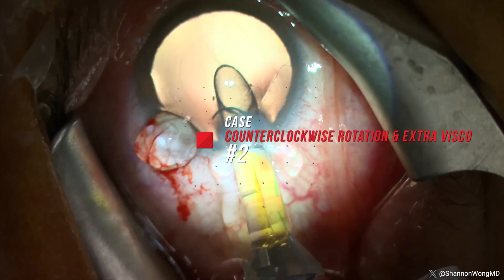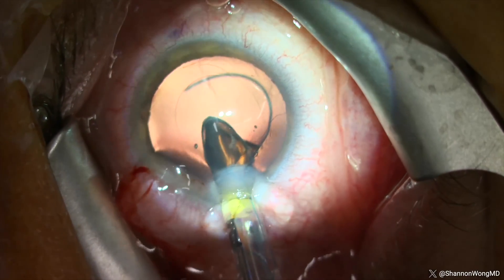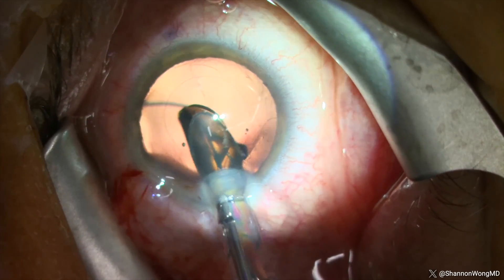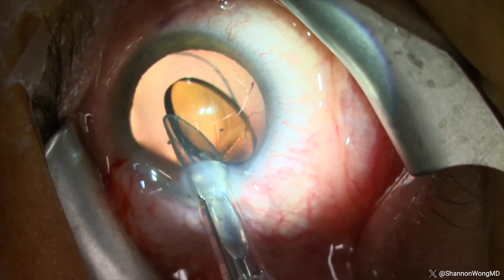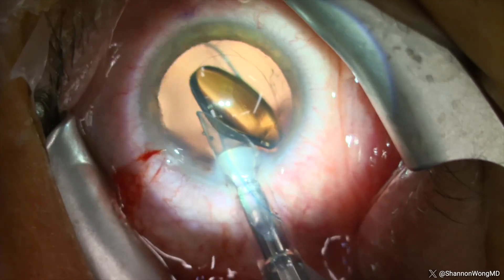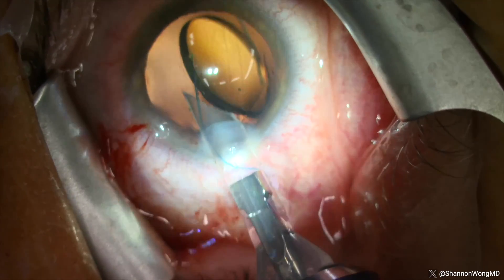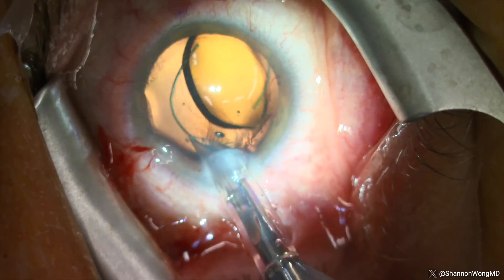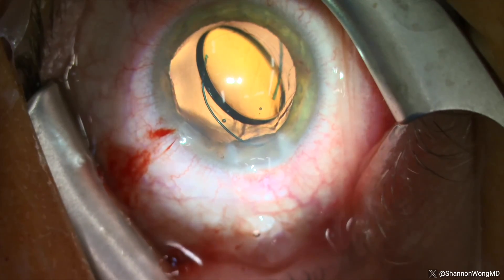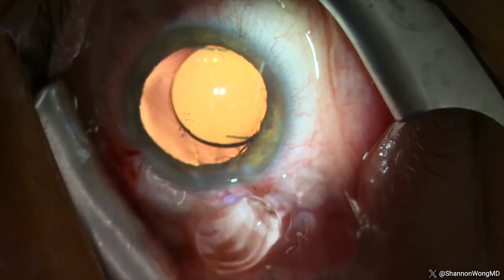Case number two: this lens requires counterclockwise rotation and extra viscoelastic. Here we are inserting a second LAL bevel down, then rotating counterclockwise to deliver the optic in the correct position. This lens exits the cartridge tilted 45 degrees when the insertion cartridge has been rotated 90 degrees counterclockwise. So it appears that to deliver the optic in a planar configuration, we would have to rotate the cartridge 135 degrees counterclockwise, which may not be possible given the orbital anatomy of some patients. We have to double clutch the metal plunger to deliver the trailing haptic into the eye, then dial the trailing haptic into the bag with a second instrument.